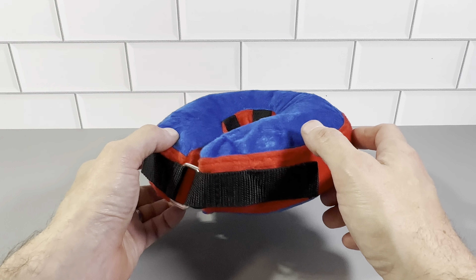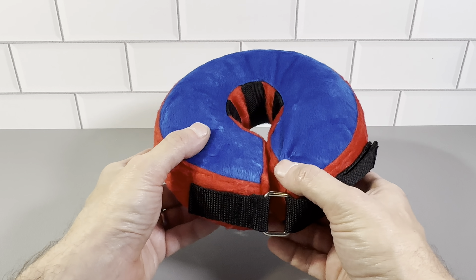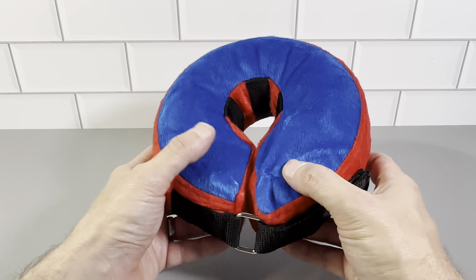This is the Billy Barra Inflatable Dog Collar. This is a really great dog collar. It's used for if your pet is recovering from a surgery or if you're trying to get the pet to stop licking a wounded area.